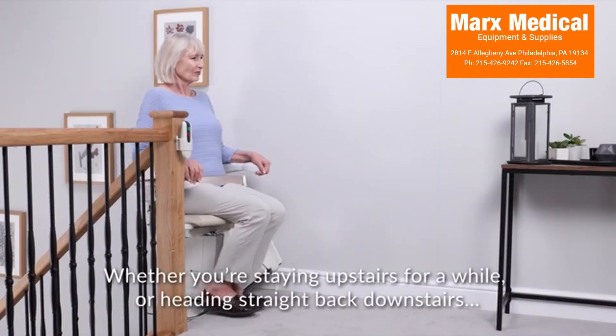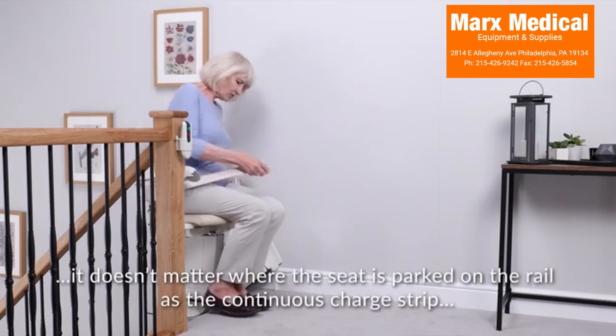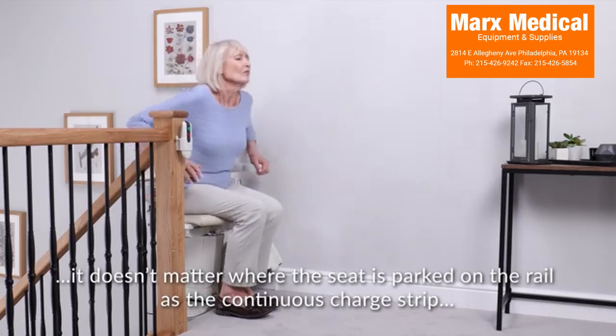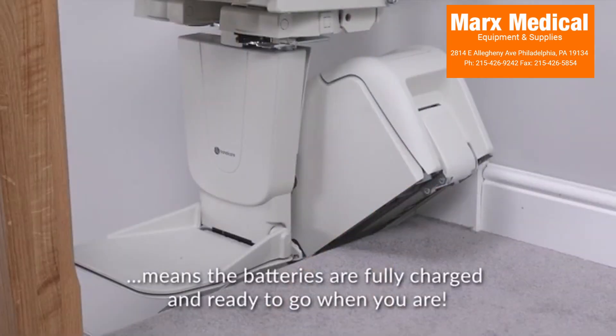Whether you're staying upstairs for a while or heading straight back downstairs, it doesn't matter where the seat is parked on the rail, as the continuous charge strip means the batteries are fully charged and ready to go when you are.